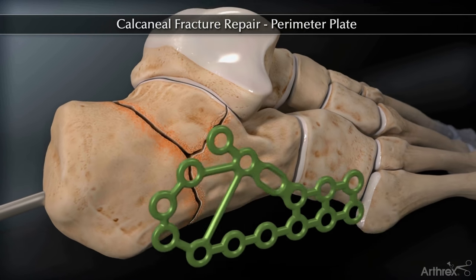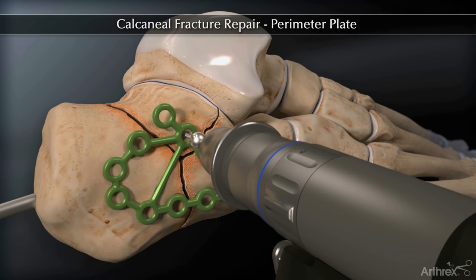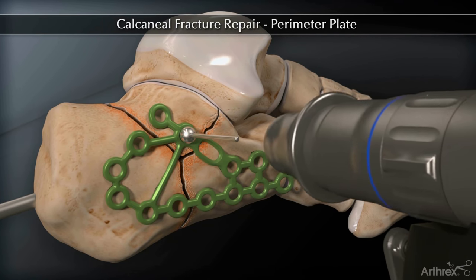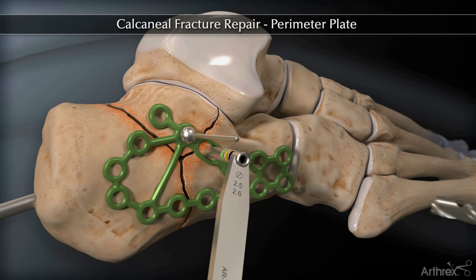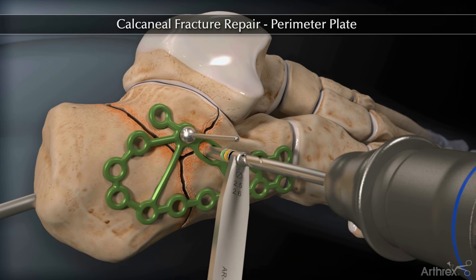Select and insert the appropriate perimeter calcaneal fracture plate. Attach a BB-tack or use the 2.5 mm drill and drill through the oblong hole in the plate to secure the plate to the calcaneus.